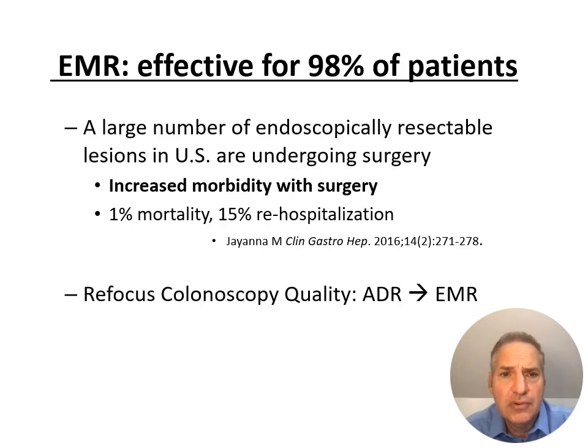EMR is effective for 98% of patients. However, a large number of patients that could be endoscopically resected are still undergoing surgery. Surgery is associated with increased morbidity, with approximately 1% mortality and 15% rehospitalization. Thus, it's ideal to optimize the EMR techniques and offer them to the greatest number of patients possible that would benefit from colonoscopic EMR.